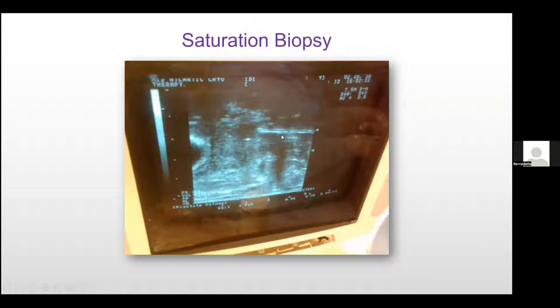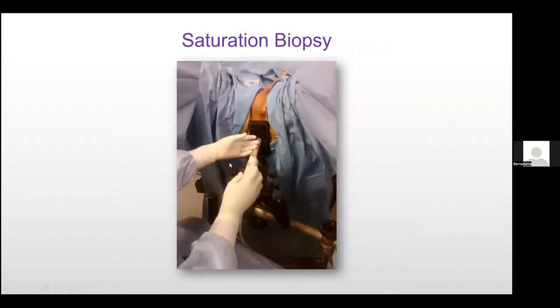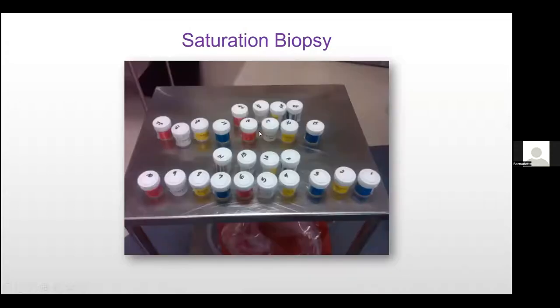And what you're seeing is the needle going into the gland in a haphazard, random sort of way, but that's the best they had at that time. And here's Mr. Mann, and he's up in the stirrups, and we got ABC, 1, 2, 3, I sunk your battleship, and you end up with this.